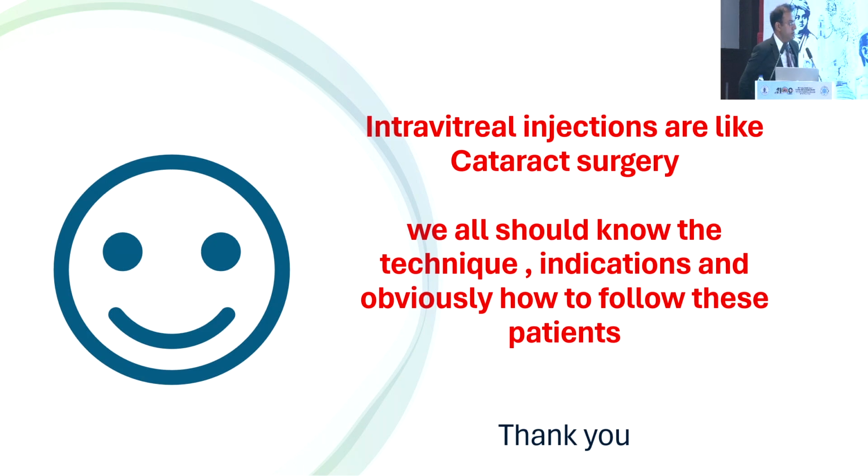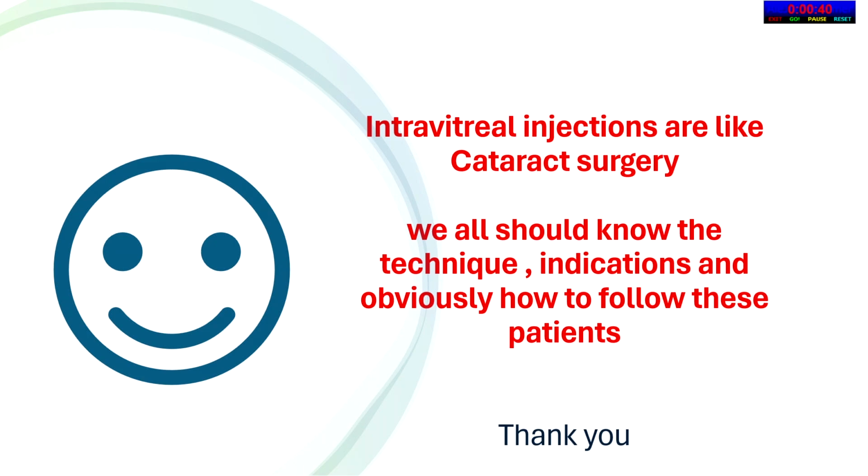Dr. Lall, very good videos. One point, would you advise them to check the hand movements after the injection so that there's no CRAO from increased volume and IOP? Ma'am, I usually don't do this, but what I do is that I just check the pressure. And the pressure should be okay. With one injection, usually I've never seen that the pressure goes so high.